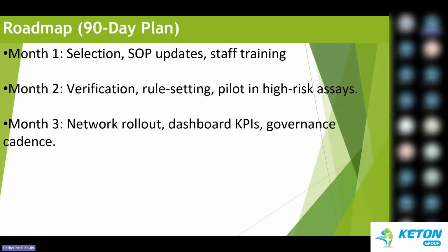You want to see how it's performing, then checking the trends and analysis, the LJs, checking on anything that needs to be verified. And then you want to ensure that whatever you have rolled out is working well before you roll it out fully. You want to ensure that the correct thing has been done.